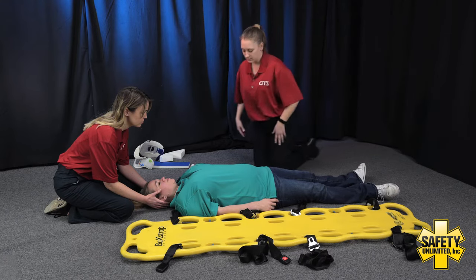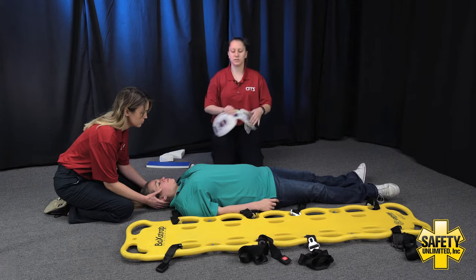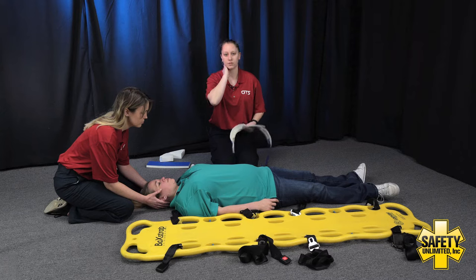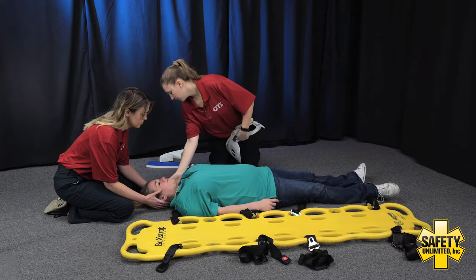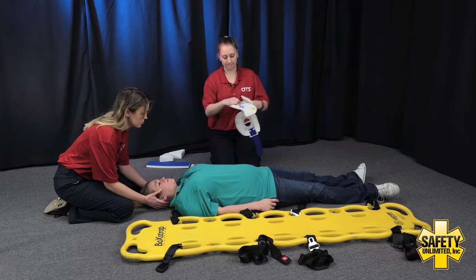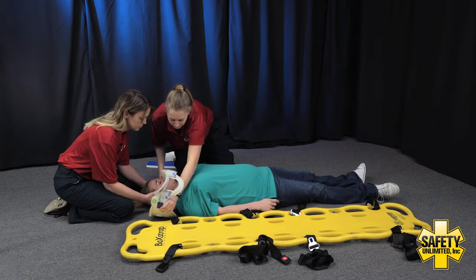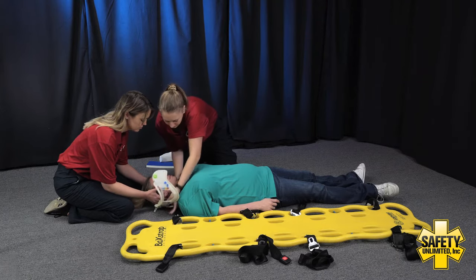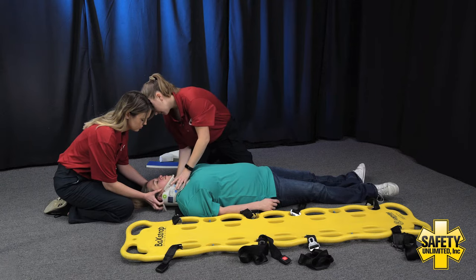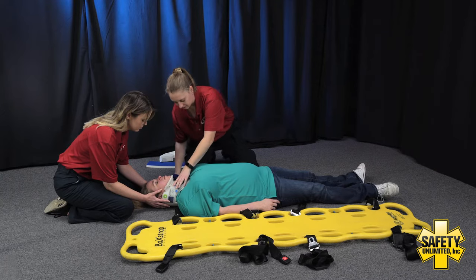Now that we've checked CSM in all extremities, we're going to go ahead and size and fit an appropriate C collar. To size, we're going to take our fingers and measure from the patient's angle of their jaw to the top of their shoulder. Now I'm going to have my EMT assistant slightly lift up the head and neck, keeping in that neutral inline position. Making sure our C collar is nice and in place.